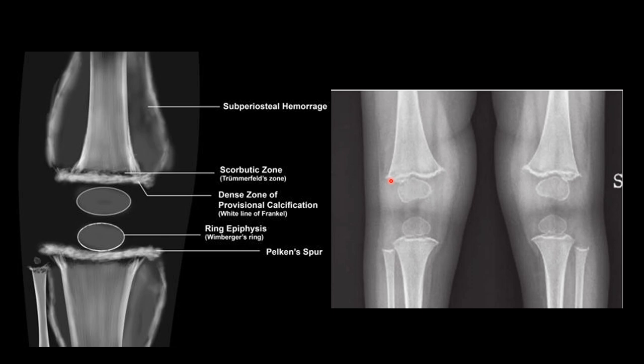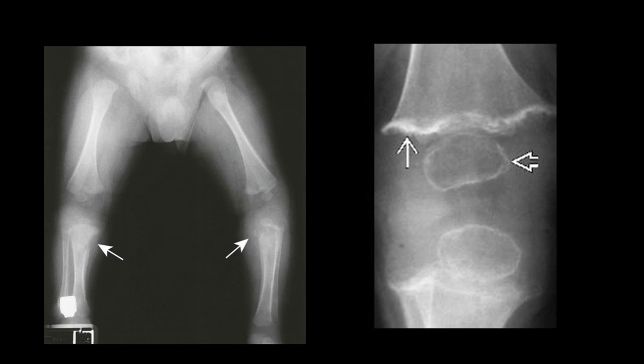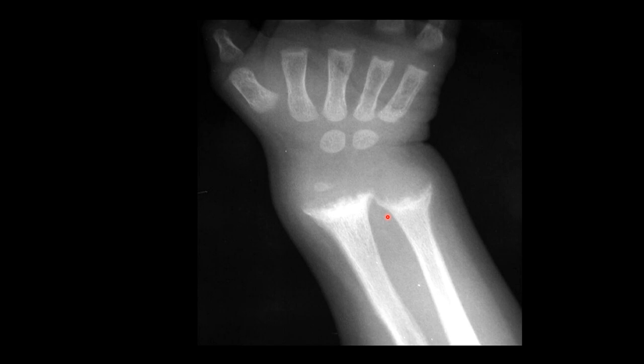If we see this on a radiograph: number one is the white line of Frankel, then the lucent zone which is the Trümmerfeld zone, this is the Wimberger's ring — the white line surrounding the epiphysis — and this is the pencil-thin cortex. In another image of scurvy, we can see the white line of Frankel, the Wimberger's ring, and the pelican spur.